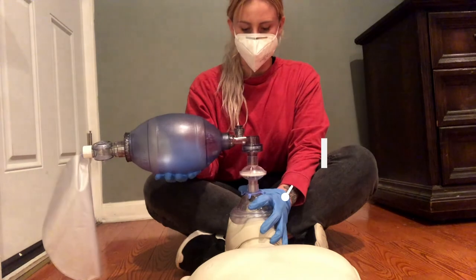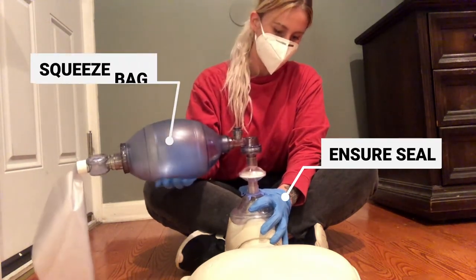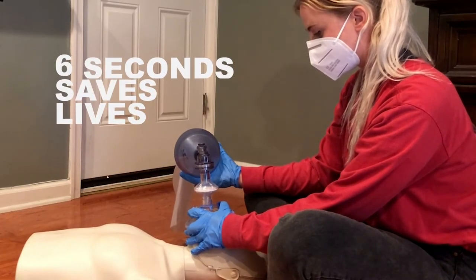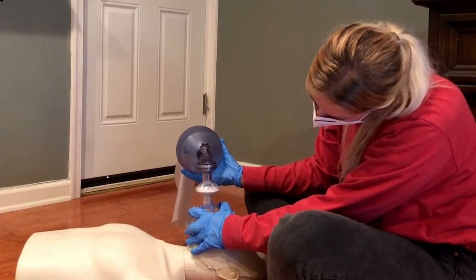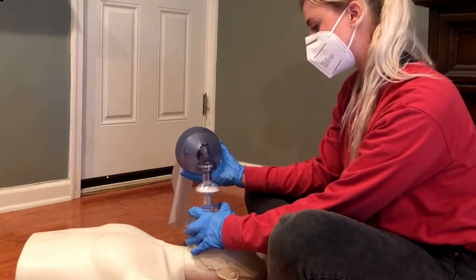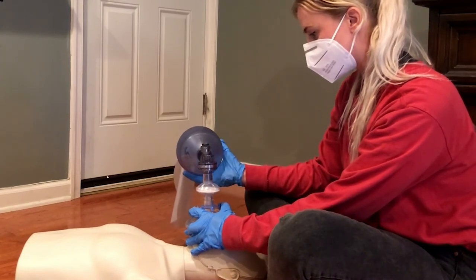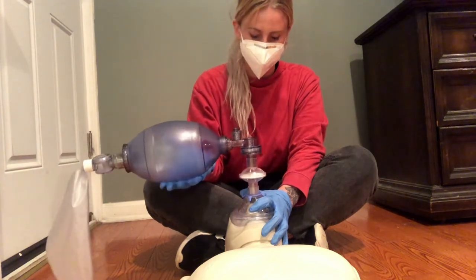Make sure you keep a tight seal around the person's nose and mouth with one hand and squeeze the bag with the other hand. Squeeze the bag once every six seconds, and each squeeze should last about one second, providing just enough air to see the chest rise. Give 10 to 12 breaths per minute. Count out loud to keep track. Make sure you wait the full six seconds — you don't want to overventilate because it can cause a greater chance that the air will get into the stomach.